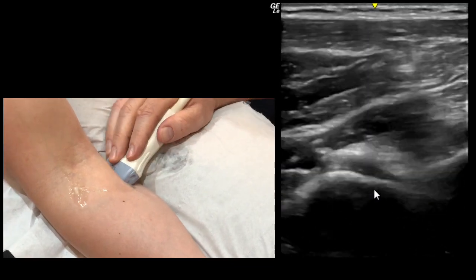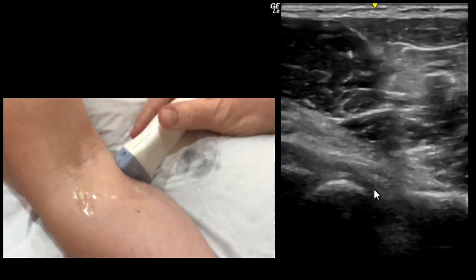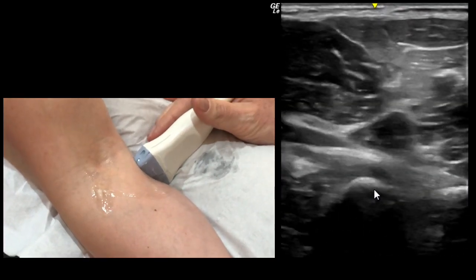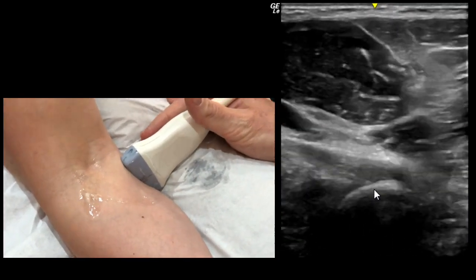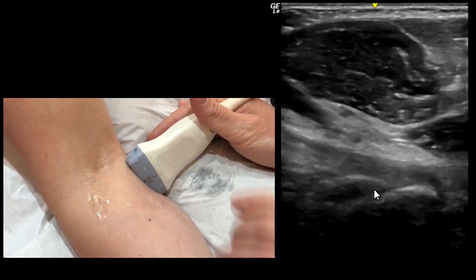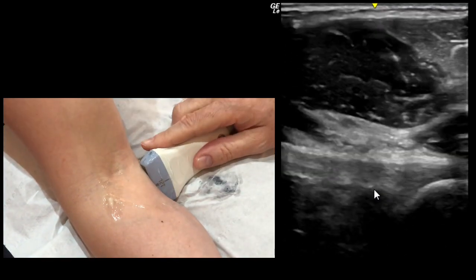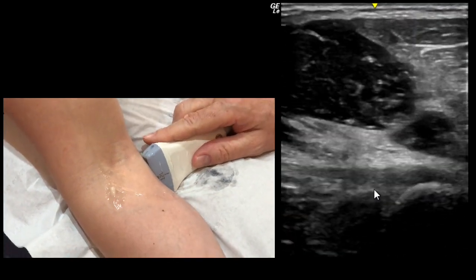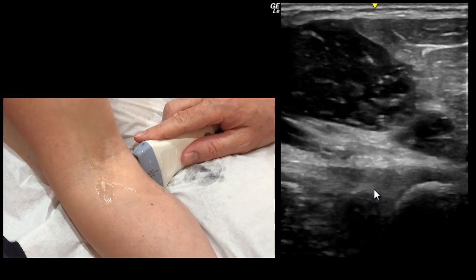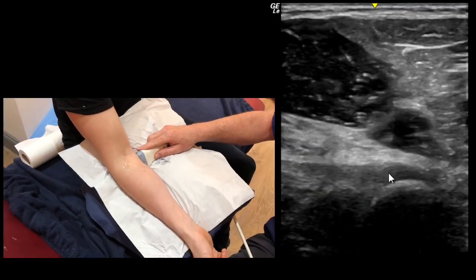Now turn the probe 90 degrees. This is your long section. I just have to change my grip so I hold over the top — and there you have the long section of the biceps inserting into the radial tubercle here.